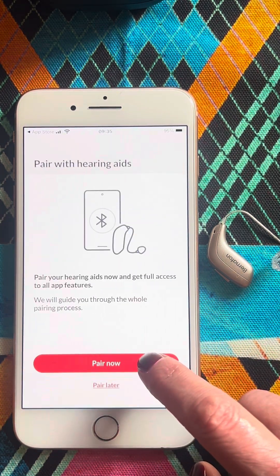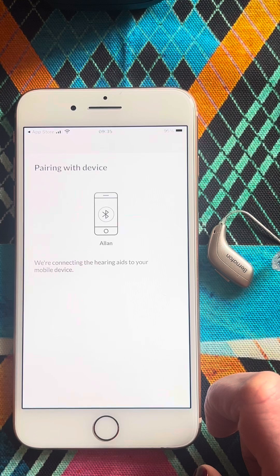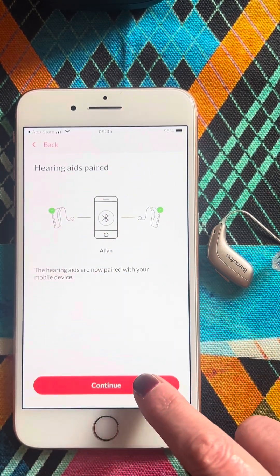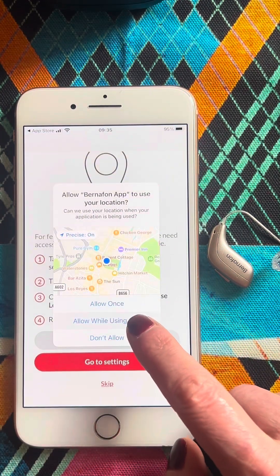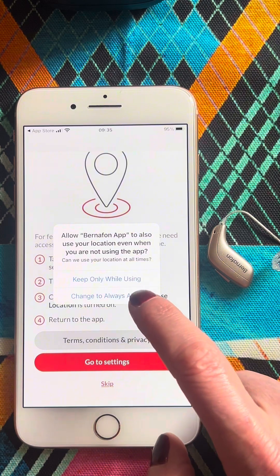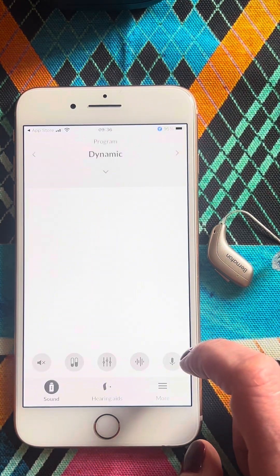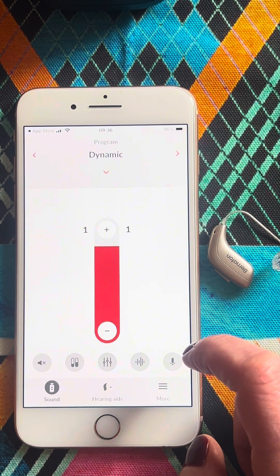We will now pair the instruments to the app. Both instruments are now paired — we click Continue. We allow whilst using the app, and I like to keep this on to always allow. So here we have the app, and I'm just going to talk you through the various controls on here.